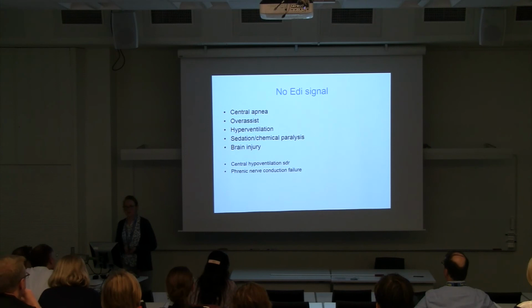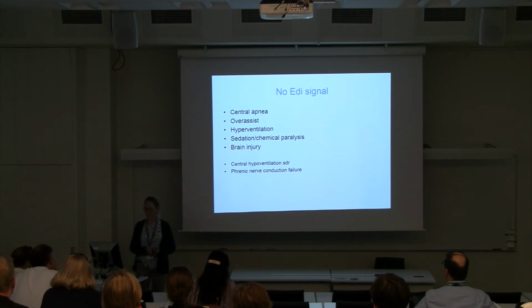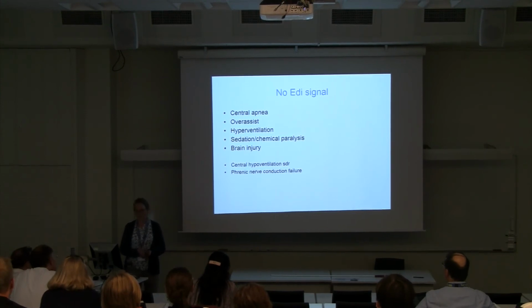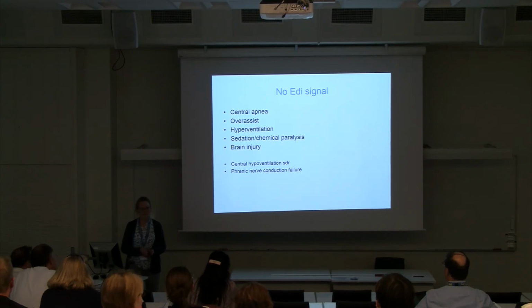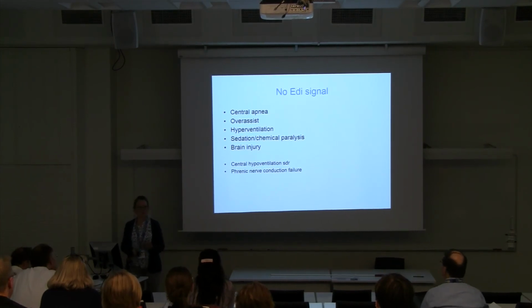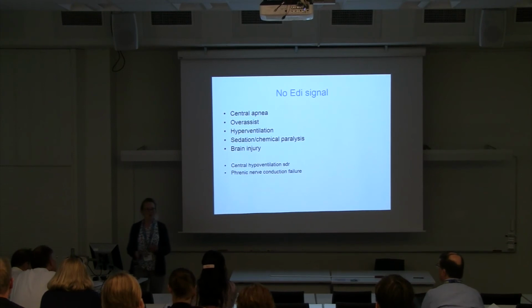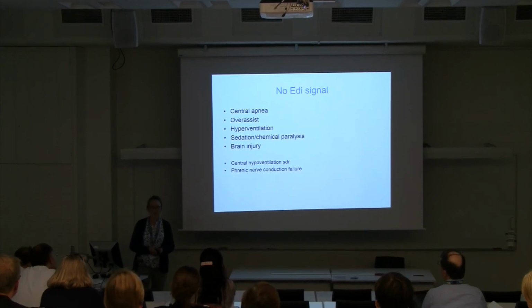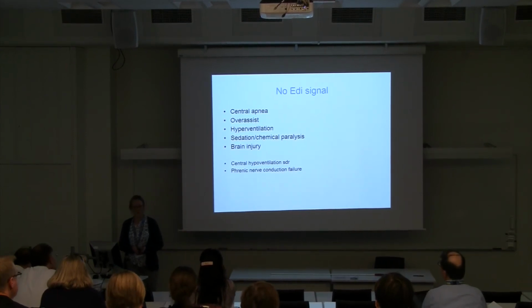Then there are some cases when there is no EDI signal, and I talked already about the central apnea and the risk of over-assist or hyperventilation. However, when the baby is switched to backup ventilation, as soon as the EDI signal returns, the baby is automatically switched back to NAVA ventilation. There is no EDI signal if there is too heavy sedation, or if the baby is paralyzed.